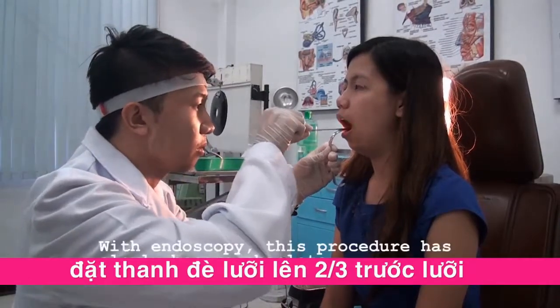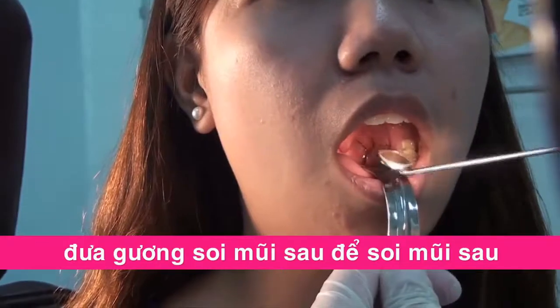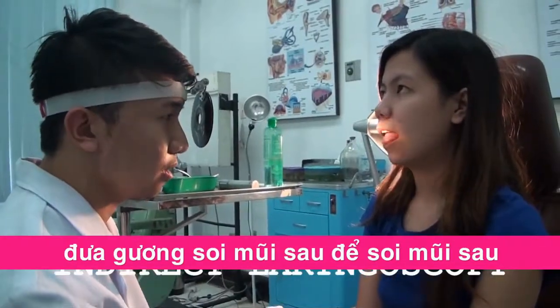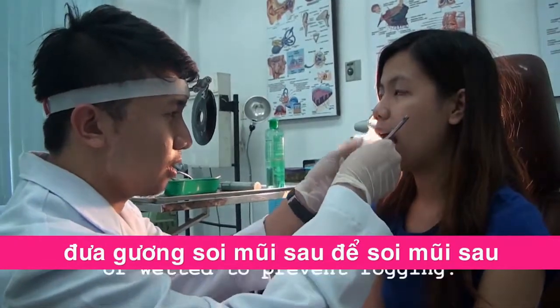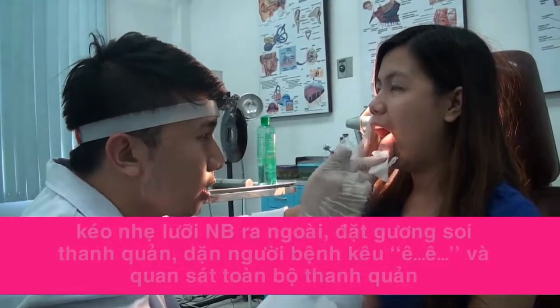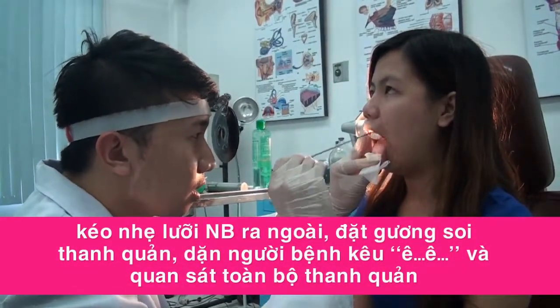The tongue is carefully depressed, and then a pre-warmed mirror is introduced between the soft palate and posterior pharyngeal wall. Indirect examination of the larynx is performed with a laryngeal mirror. The examiner grasps the protruded tongue with gauze and pulls the tongue forward. Advance the mirror beneath the palate to the uvula.